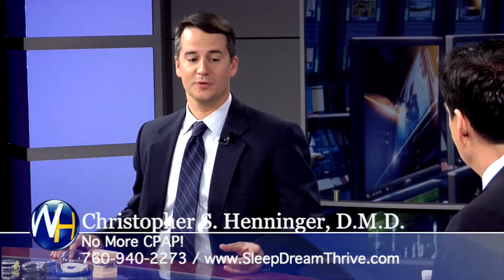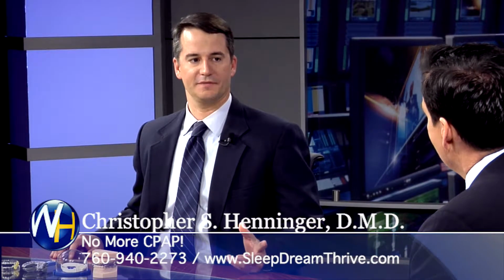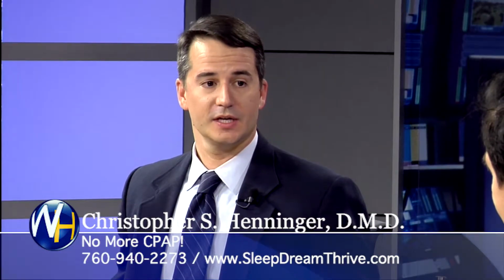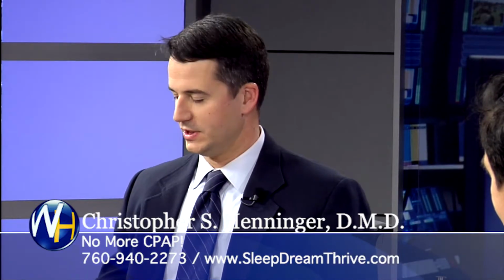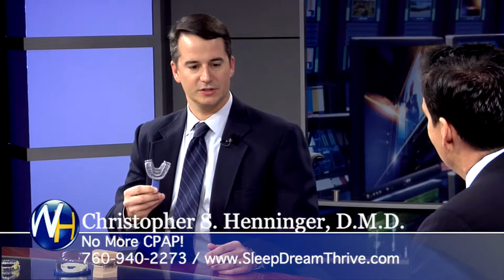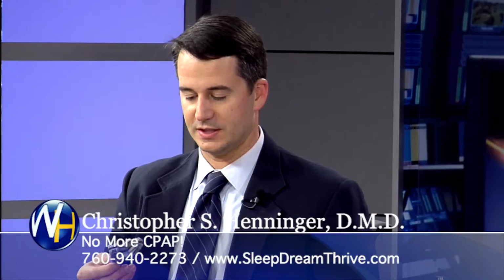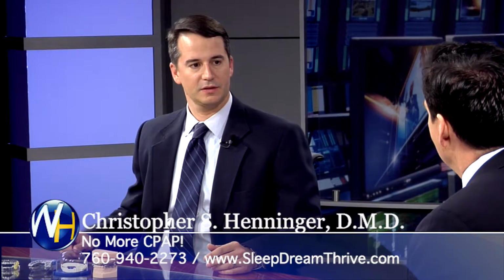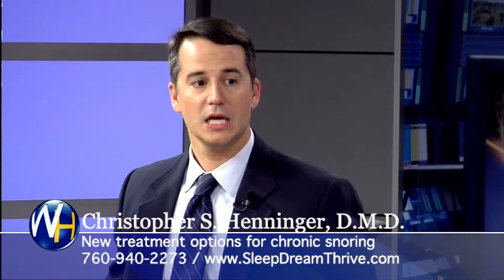Yes. Very quickly. We have a device that's approved for 30-day use by the FDA. It's a temporary device. If you're struggling with your CPAP and want to know if this is a good option for you, we have a temporary device that we can make for you in the office. It's like a retainer in a way? It is. It sits on both your upper and lower teeth and advances your lower jaw forward, hopefully bringing the muscles out of the back of your throat that are preventing you from breathing. It's like a tryout to see if it works.